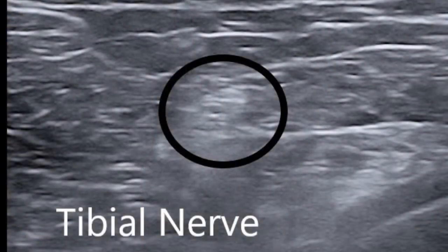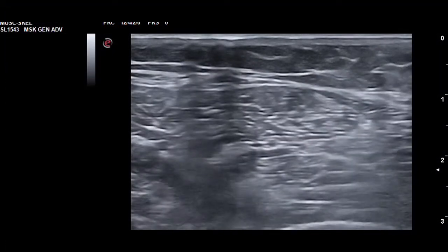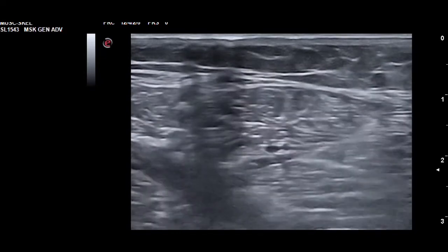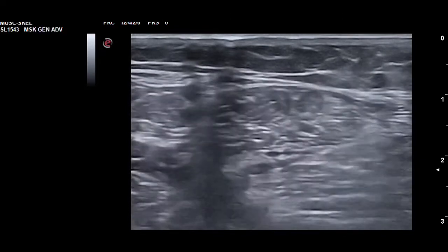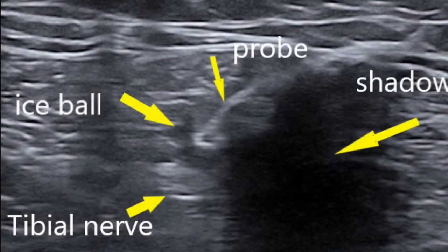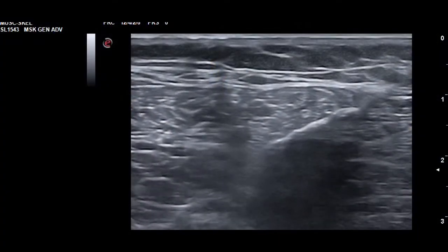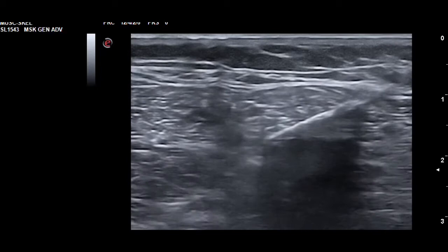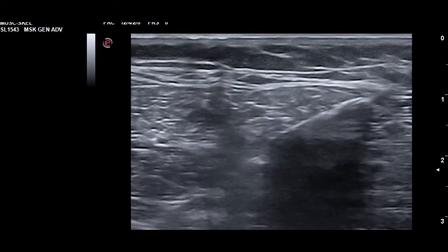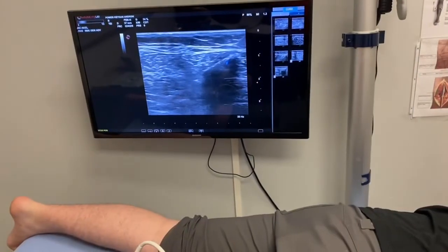When we target a tibial nerve — in this case a whole trunk for an equinovarus foot — we are able to localize it. The smart tip has a built-in electrical stimulator that we attach to our own stimulator, so we're able to target at very low amplitude at one milliamp maximum. Then as we turn on the gas, you can see the ice ball forming. This will cause the electrical stimulator to stop being able to stimulate as we are actively freezing the nerve, and we will see that 1.0 milliamp drop, and you can see the shadow being generated as the gas is being delivered and the probe is freezing.